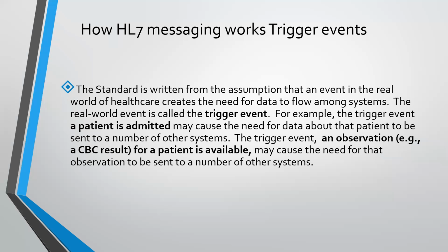In this way, the entire patient cycle, from the point the patient enters into the hospital till he leaves, all the workflow related aspects are broken down into chunks of events. Now it is secondary whether that event related data has to be transacted and be sent from one system to another or not. Primary is the entire hospital is divided into chunks of events.